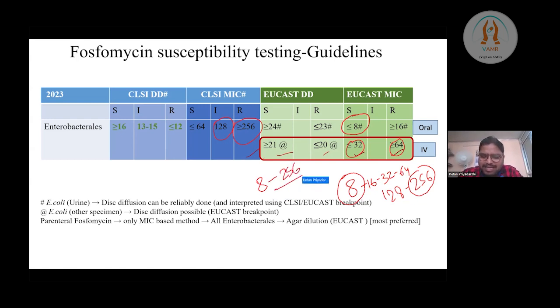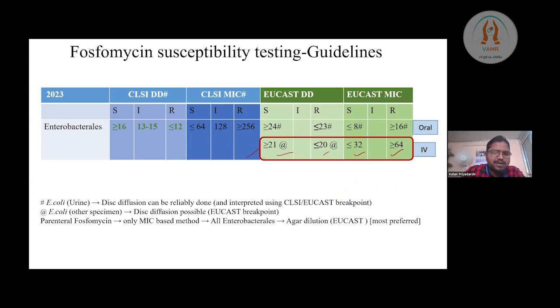This is one point that we'll be discussing subsequently. I mentioned it here because we have a breakpoint range here. Remember, we'll plan this test in this range so that everything available as a breakpoint will be covered. There is one more reason for covering this range that Saru will tell subsequently. 8 to 256. Okay, go ahead, sir. Thank you, sir.